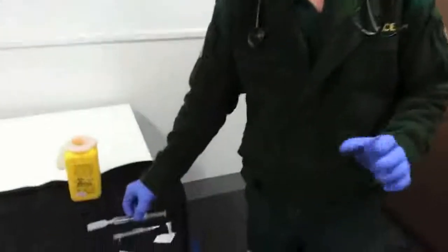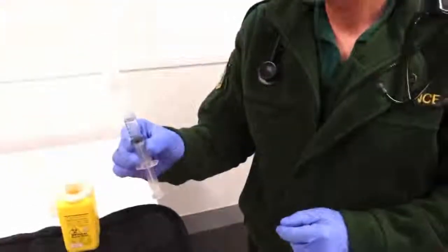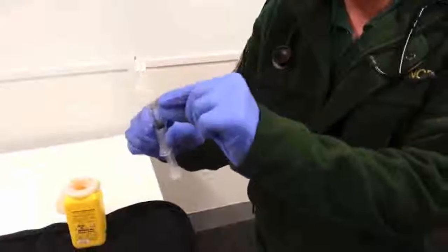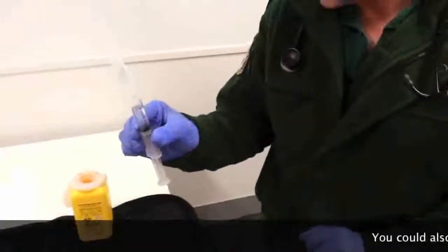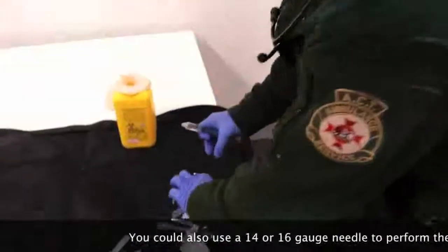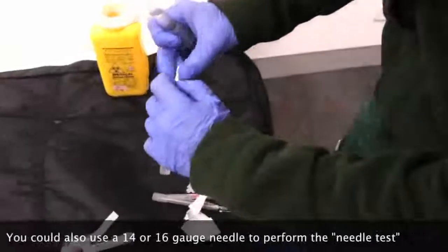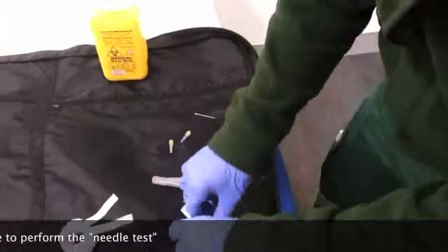I'll take you through the needle test as I mentioned earlier. What you need is to draw some normal saline in a syringe and give yourself a couple of centimetres of space there. Then we connect up the dwell cath. Okay, pop that down there.